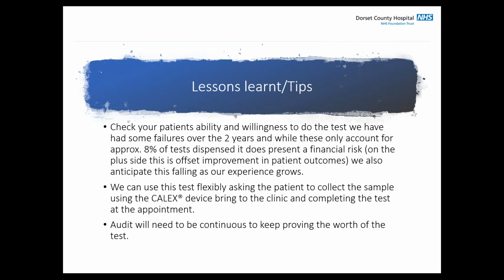Other tricks that we have also found, and it often depends on the quality of the phone that they're using, are things like making sure that the light that they use for taking the first photo or the camera test is the same as when they take the actual test picture. So that's another hint that we use. But failing that, most of our patients seem to get on really well with it and report no problems whatsoever. So really, that's it in a whistle-stop tour of 2 years' experience, but we're finding value from it all the time.